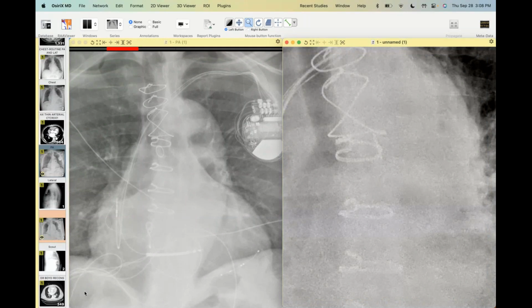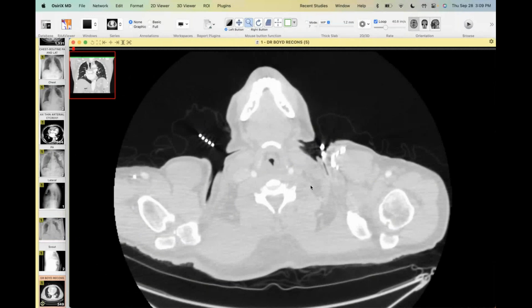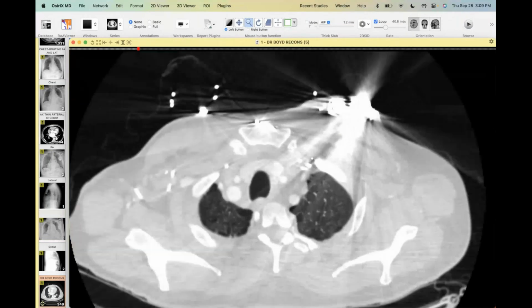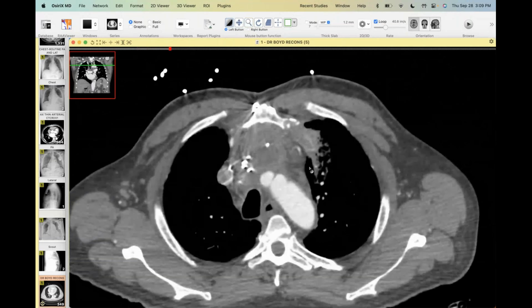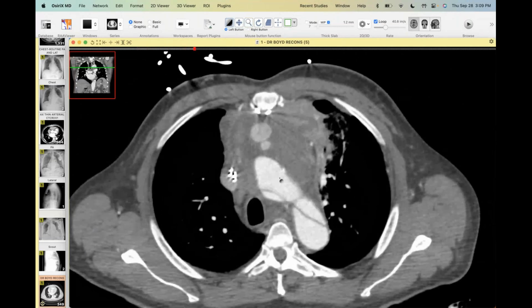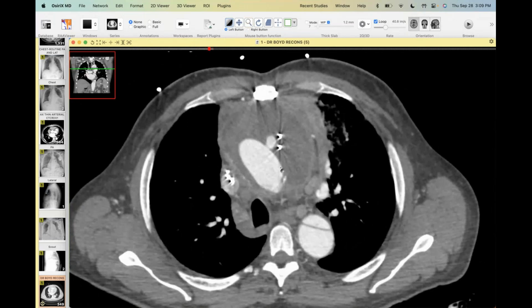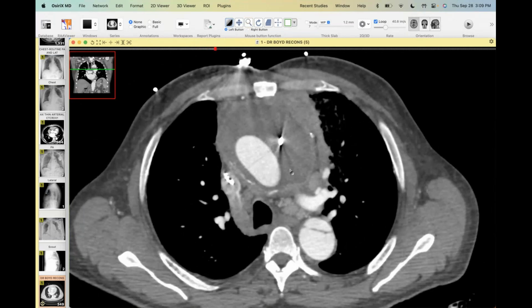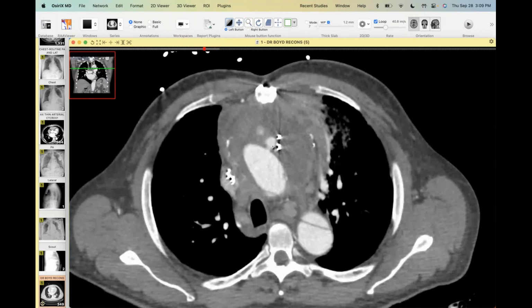And so here's the CT, and you'll see what it shows, based on the clue of the migration of that ostial marker: there's a huge pseudoaneurysm now. That wasn't here even a year ago, prior to that AICD being placed. And sure enough, there's that ostial marker that's displaced, and you see the blush of contrast right next to that.